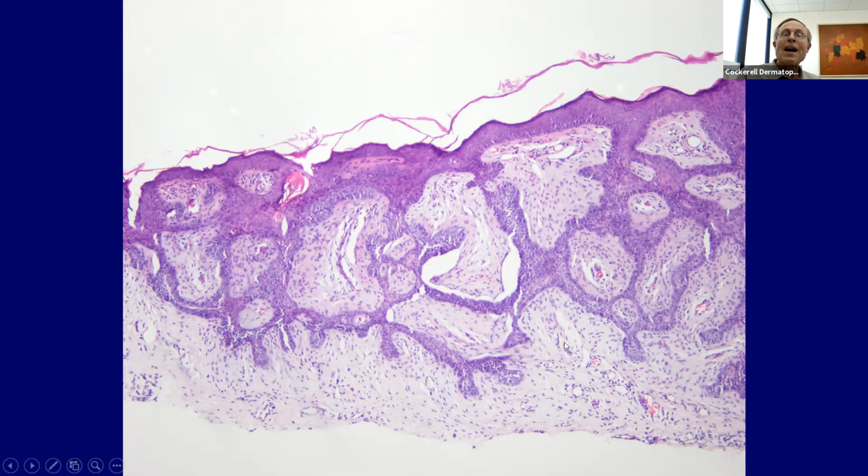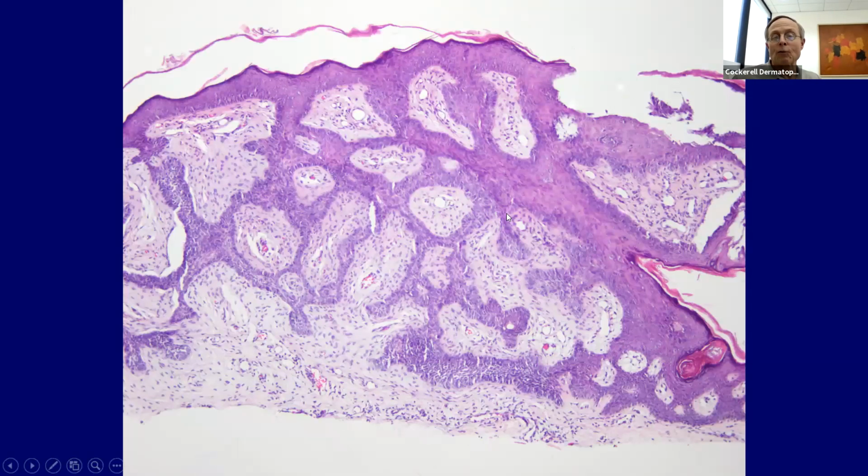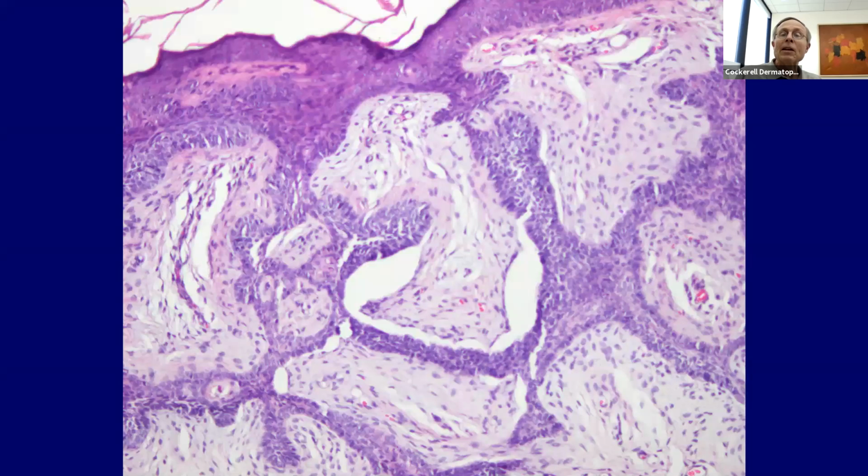Yeah, fibroepithelial tumor of Pinkus. And the differential diagnosis is TFI, but that doesn't usually give you quite as much basaloid differentiation. If you just had like here only, kind of this superficial, and they're more kind of like these mantle-oid areas here, that's a better diagnosis. But once it gets down into here, you're in the fibroepithelial tumor of Pinkus category. And that's thought to be a variant of basal cell.